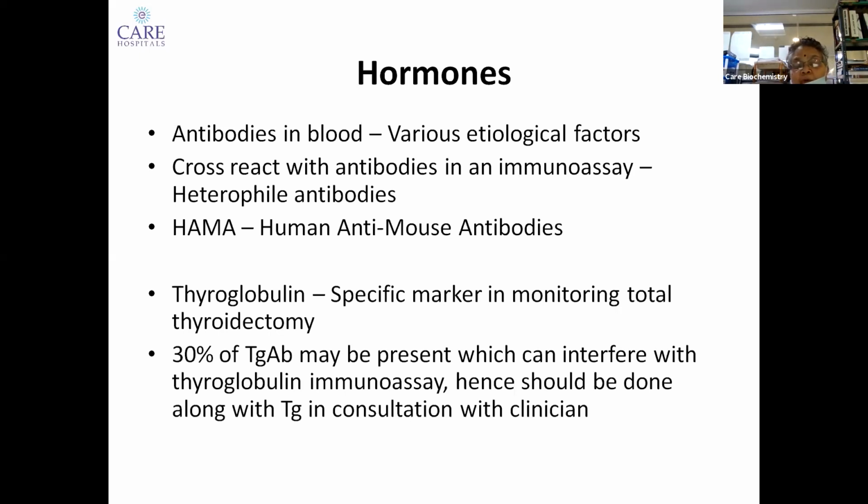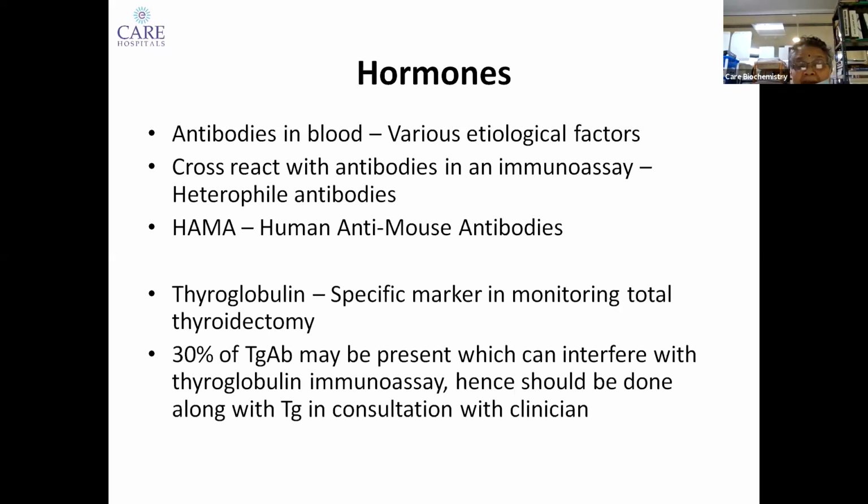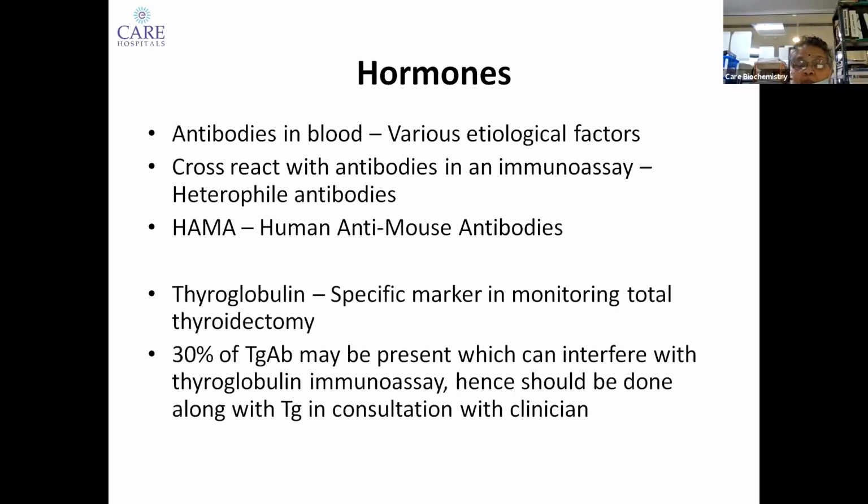I have been in a soup once where an elderly patient, a doctor, retired, a family friend, says, I come to your lab because you are there. And on the dialysis bed, the TSH was not what he usually got. Then we had to check the lot. What happened? We tested it in 3-4 labs, 2-3 labs agreed with us, 2-3 labs did not agree with us.